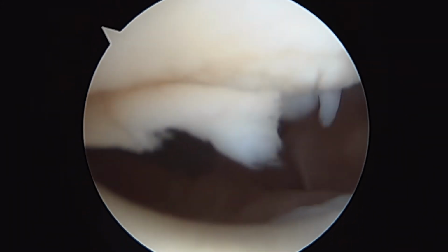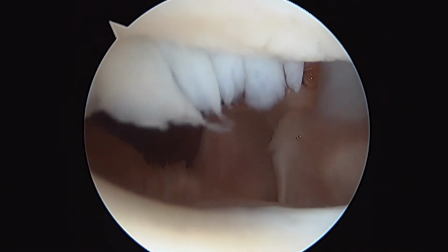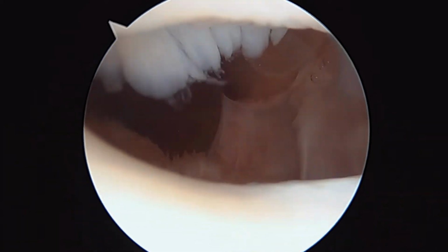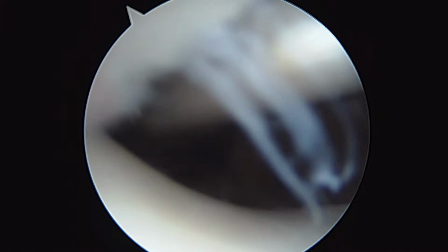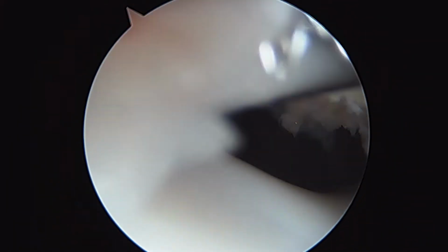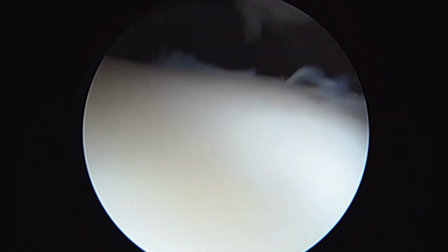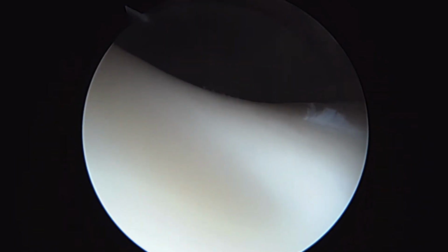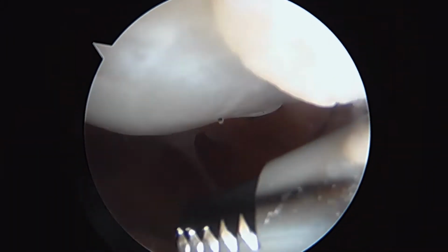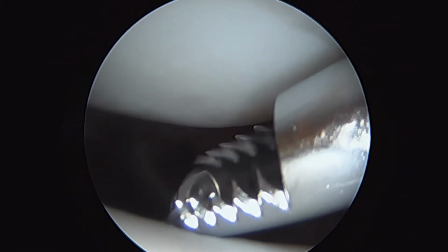And here we are looking at the top of the screen. Shaver. As you take away a little bit of the fat pad so we can see, we'll get a much better look at the patella in just a minute. Okay, so here's the patella at the top of the screen. It looks great. I don't see any cartilage damage here all the way out to the lateral facet.